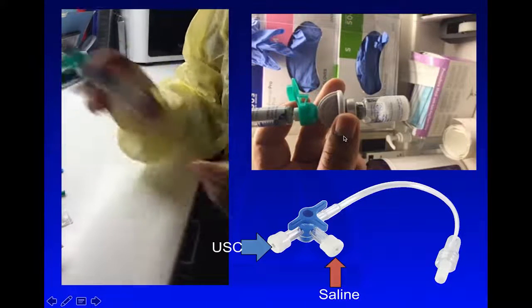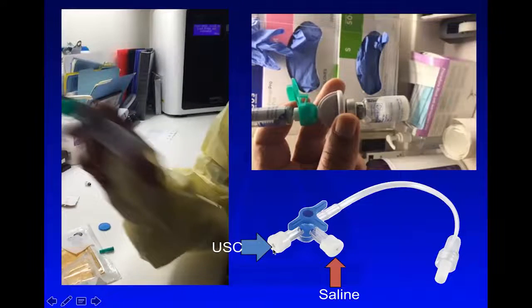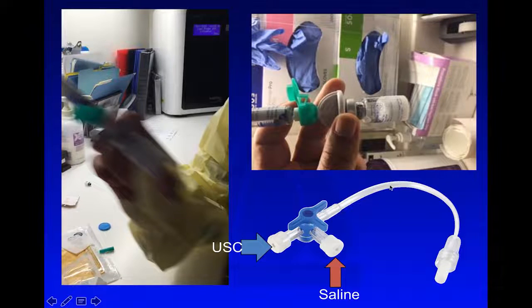And another little tip is that when you inject the contrast, you have to make sure that the contrast is injected in the line that goes straight to the patient, and the saline is injected at 90 degrees, because you don't want the bubbles to have to take this turn and be destroyed.